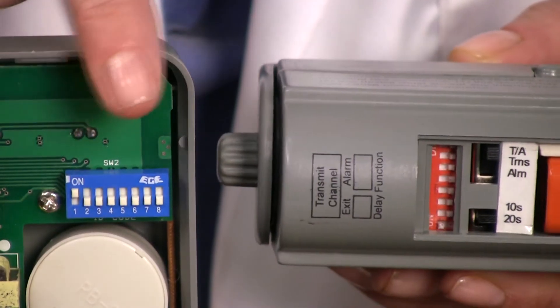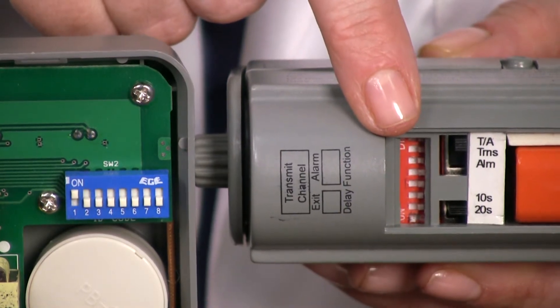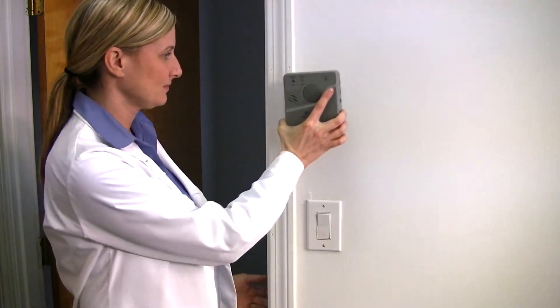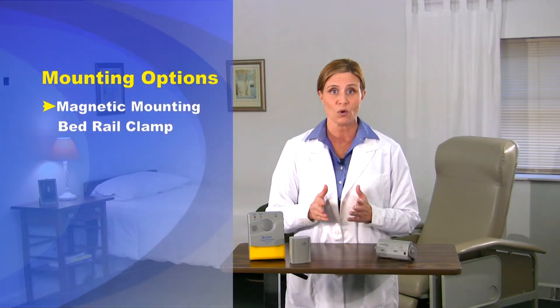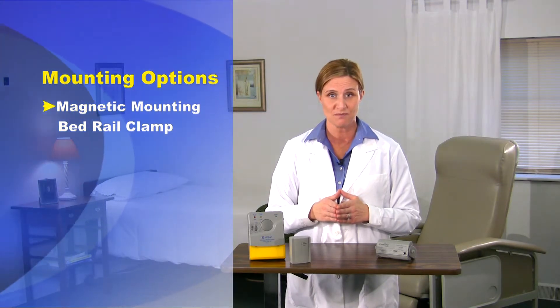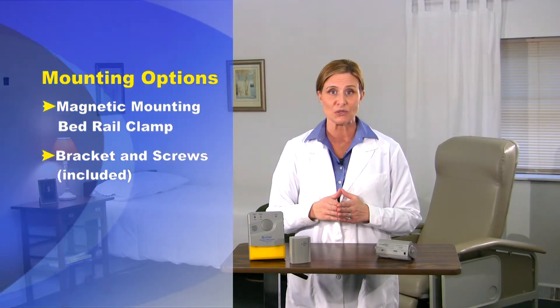After installing four C-cell batteries, pair the remote receiver to both the nurse call receiver and local PIR alarm unit. This is achieved by using the blue dip switch module above the batteries — set each of the eight white switches to match the positions of the PIR unit. Once you've established communication with the PIR unit, mount the receiver unit to the desired location up to 100 feet away. There are three mounting options available: you can mount the unit using the magnetic mounting bed rail clamp available separately, using the included bracket and screws, or by using the included double-sided adhesive.